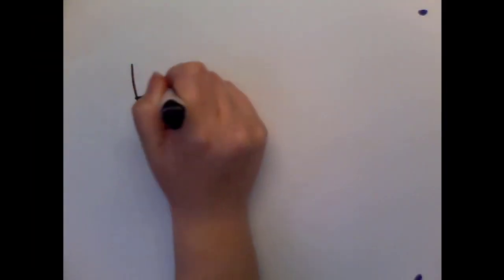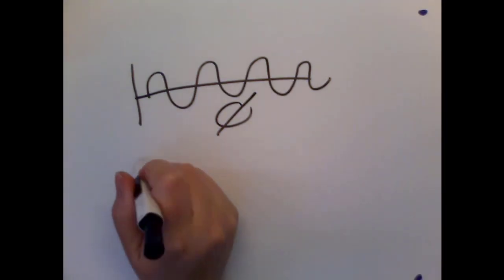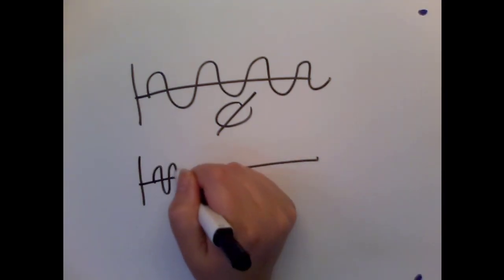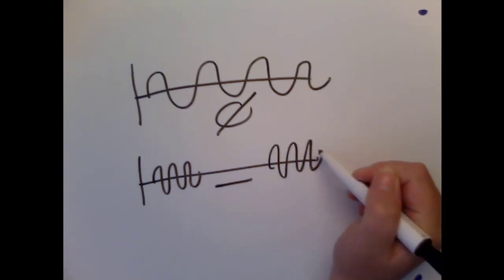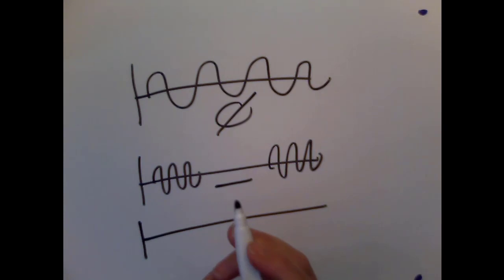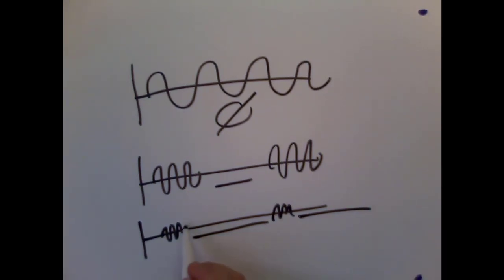And I just want to highlight a little bit more. We talked about continuous wave, right? We have our continuous wave. This cannot create an image, right? Because there's no off time. So then we learned about pulse waves, and we know pulses come out, we have that off time, and then we have another pulse. With that backing material, what we end up getting are these little chirps, and then lots of listening time. Little chirp, lots of listening time. And that backing material is going to create those short pulses, which is better for imaging. So that's why we have that backing material.